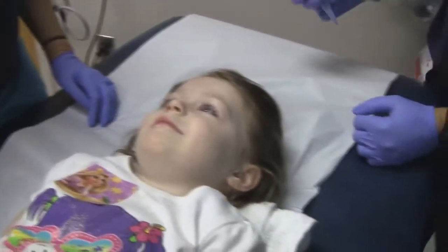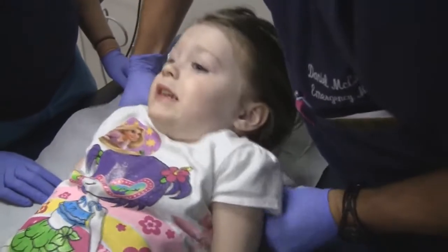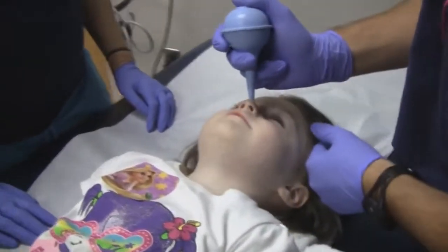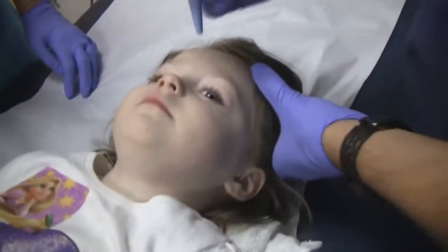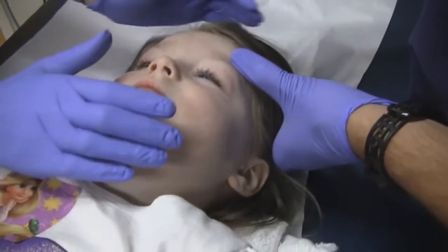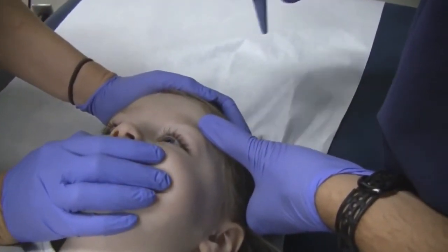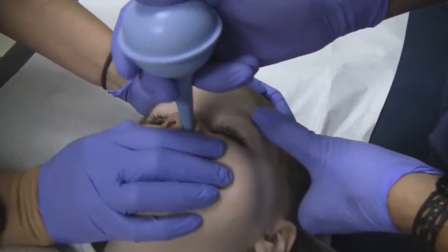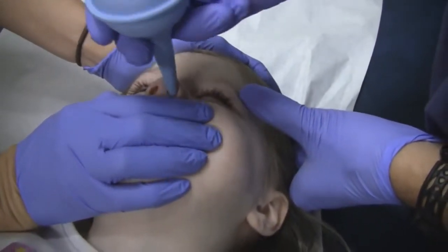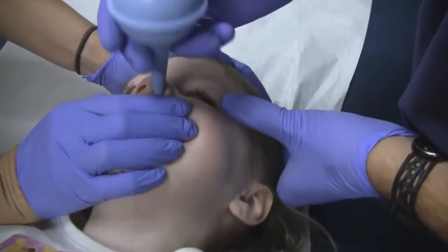We're going to blow some silly air into your nose, okay? Now what's going to be the best way for me to image this? So if I'm here, can you still see? Yeah, I think I can. Okay, you're going to try and keep your mouth really closed, okay? Rachel's going to help you keep your mouth closed. Isn't that silly? Okay, go for it. Ready? You've got to be really quiet. Here comes the air. Good job. How's your mouth? Good job. I don't think you're getting a real good seal.